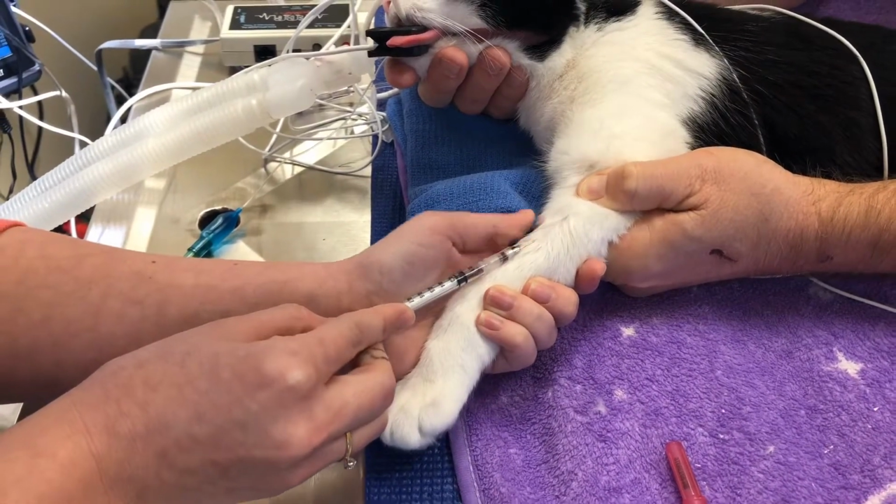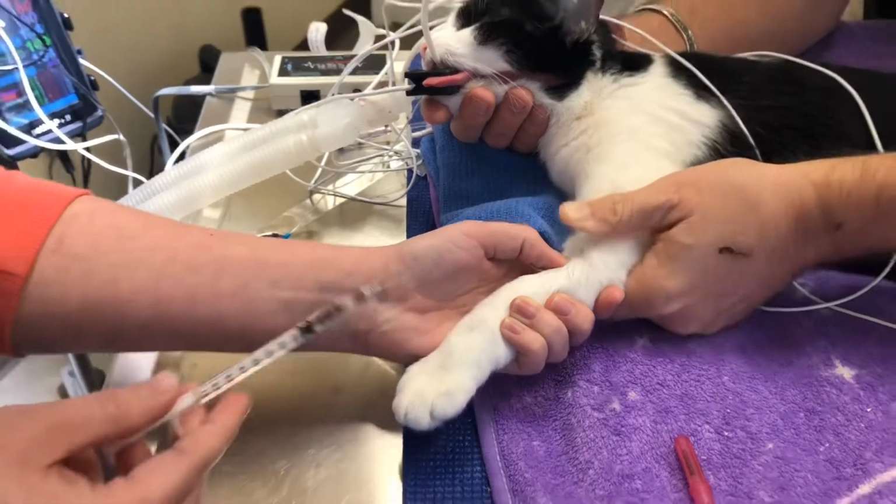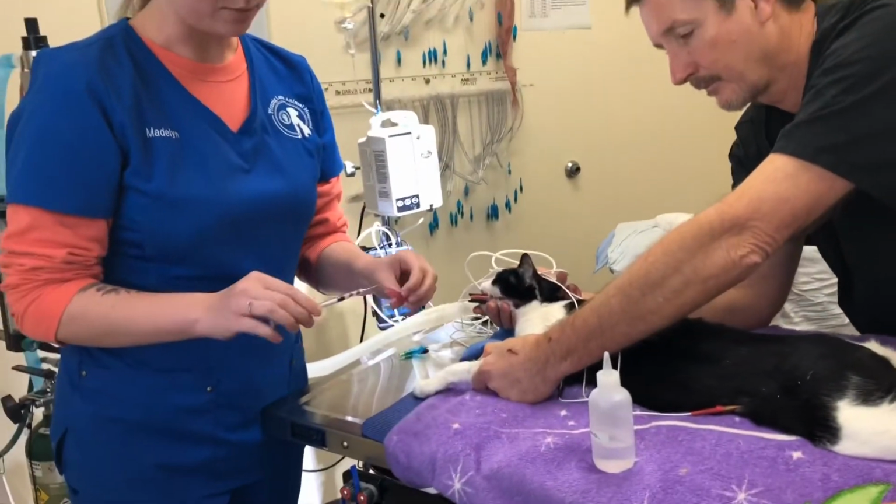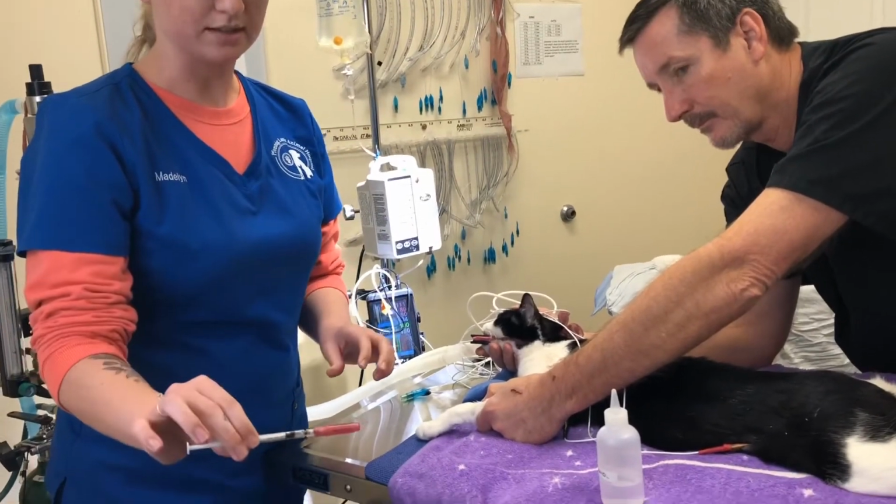Okay, when I'm done pulling blood, I'll hold off where I drew blood and then have my restrainer hold the arm for me. That way a hematoma does not develop, but that is my blood sample.